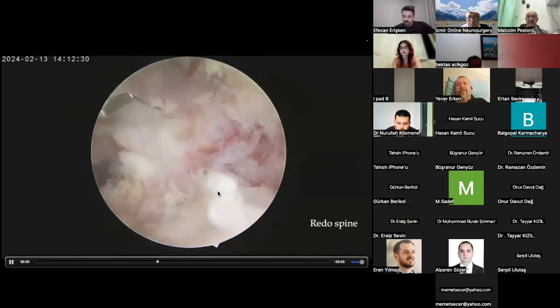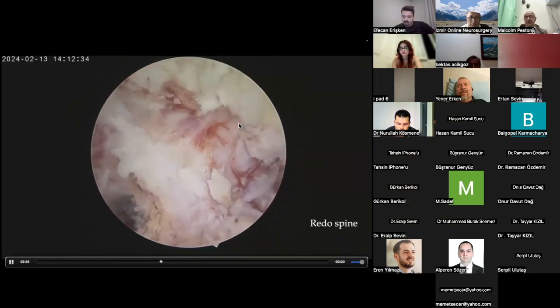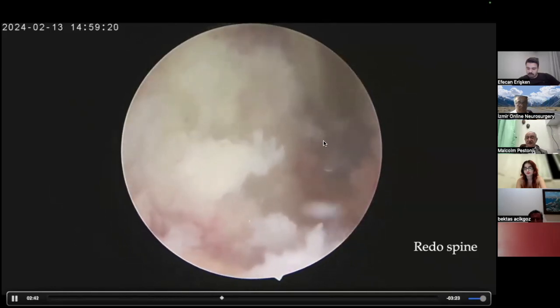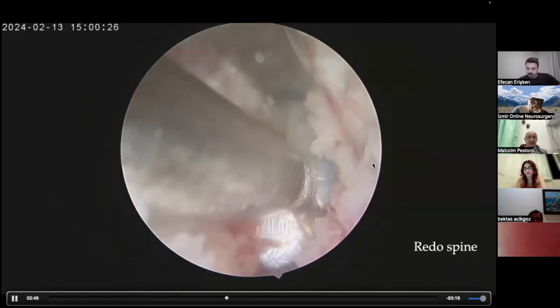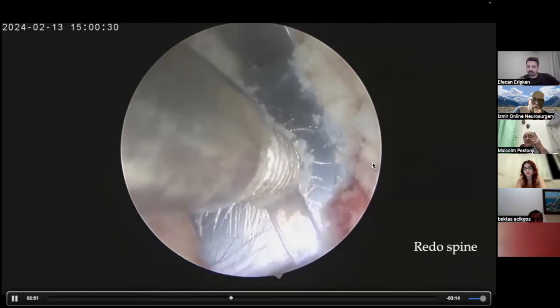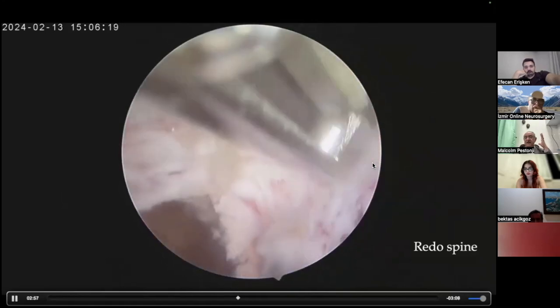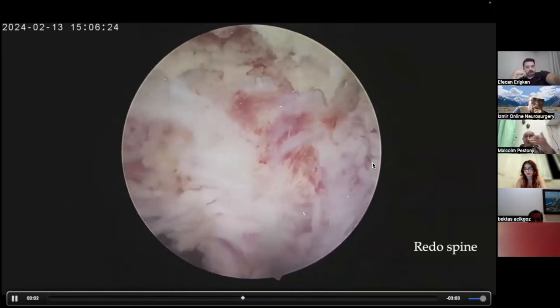I'm doing a little bit of flavectomy also, upper side, because now this fractured lamina has come out. So you can see how we are opening up the dural area. Finally, identifying the cage, seeing the entire exiting nerve root. Never remove the cage without seeing the nerve root. Protect the axilla with a thin retractor if need be, and gradually tamp out this cage. Once the cage is out, I'm completing that little hemilaminectomy that I had done by going around the axilla.